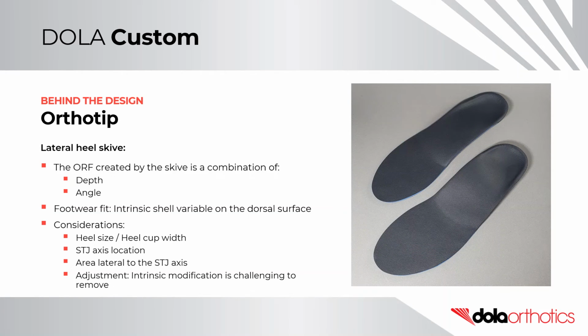Orthotip. The lateral orthotic reaction force, or pronatory moment, created by the skive is a combination of the depth and angle prescribed. It is a popular prescription option because it is an intrinsic shell variable, therefore helping with footwear fit.